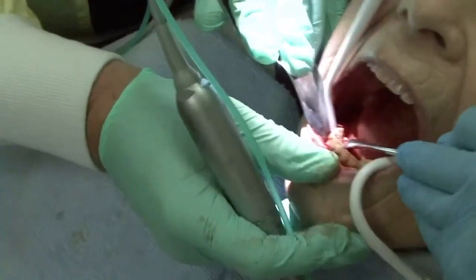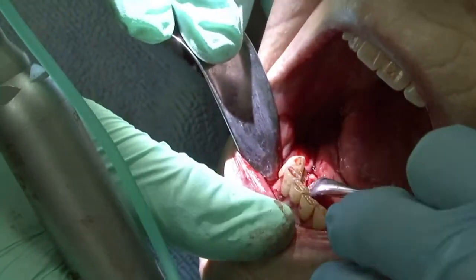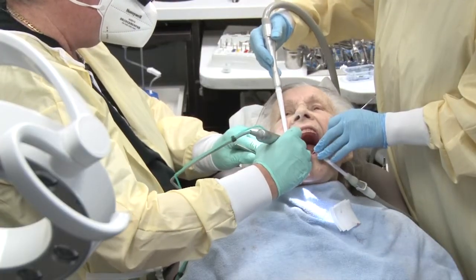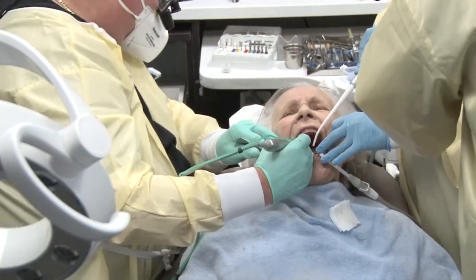We found that the bone density was a little harder than we thought, so we've decided to go up one more diameter. So we're going to 3.5.